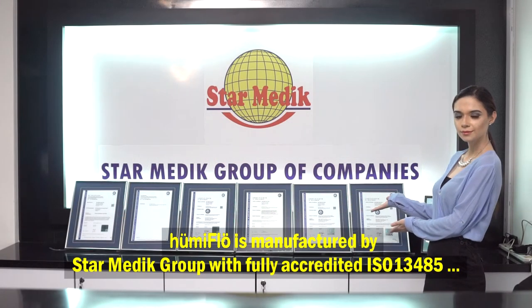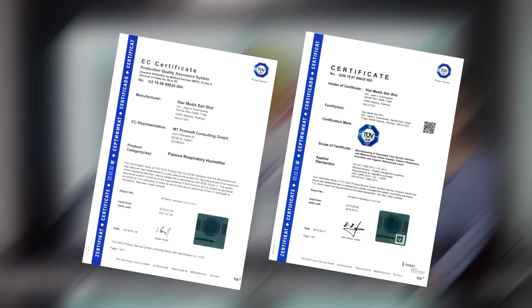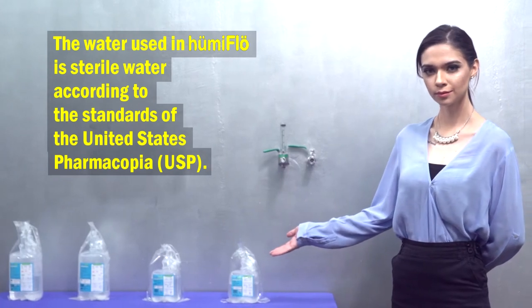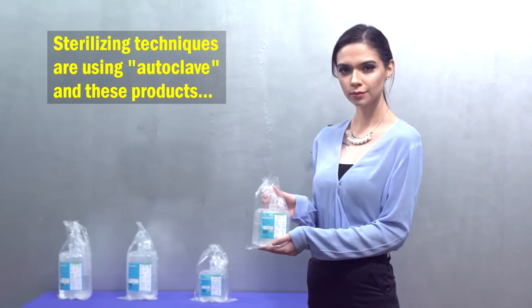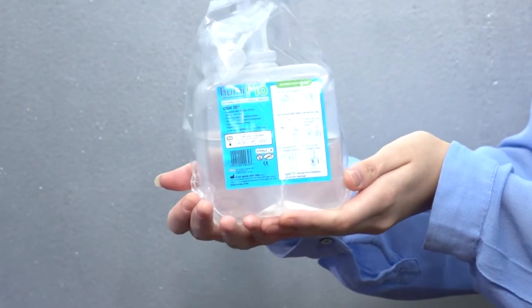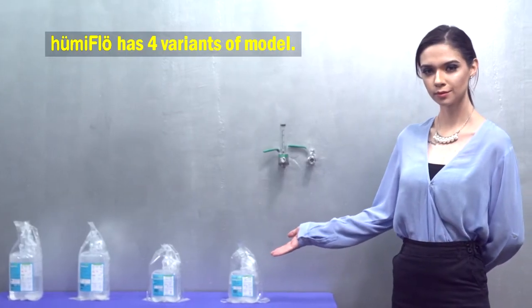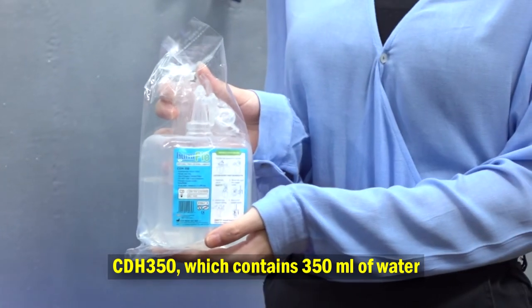Humiflow is manufactured by Star Medic Group with fully accredited ISO 13485 and CE certification by TÜV SÜD. The water used in Humiflow is sterile water according to the standards of the United States Pharmacopoeia (USP). Sterilizing techniques use autoclave, and these products do not use gamma or any radioactive material for sterilization.